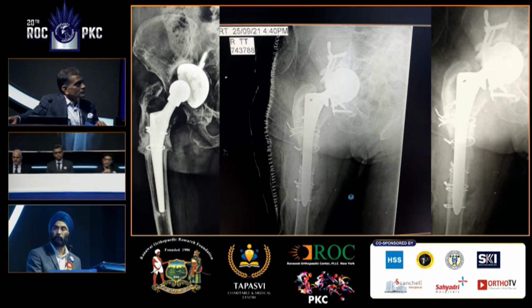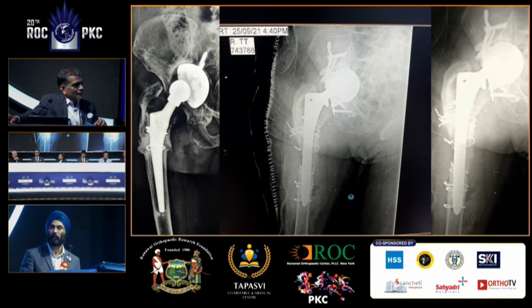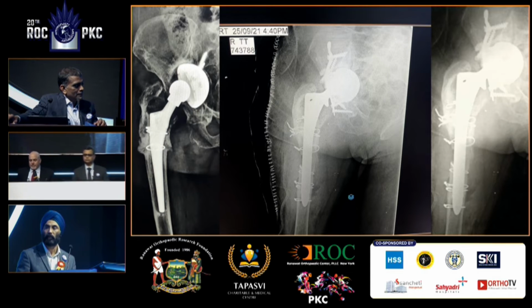Socket side, I think it's good. I probably would have used a slightly longer stem. Yeah, it was going around 4 centimeters down, so I thought it would be enough. Long stems we are not very keen on nowadays. It's a very nicely fitted porous stem. So Amar, how is it from a technical standpoint?